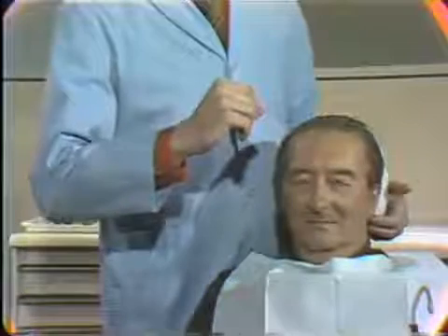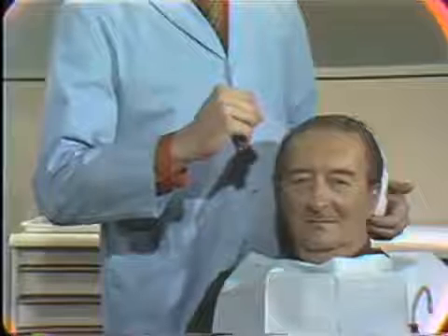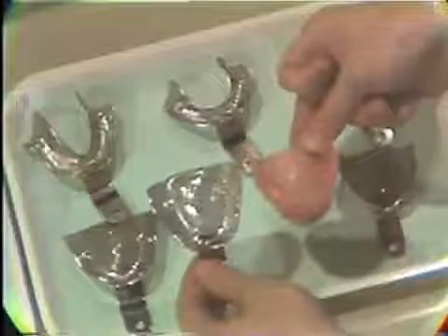After positioning the patient with the chair upright, the head supported in the headrest, and the patient's mouth at the approximate level of the operator's elbow, we are ready to select the proper tray. The patient's present denture is a useful guide for selecting the proper size of tray to be used. The purpose of this tray is to carry, confine, and control the impression material, and therefore should be slightly oversized.